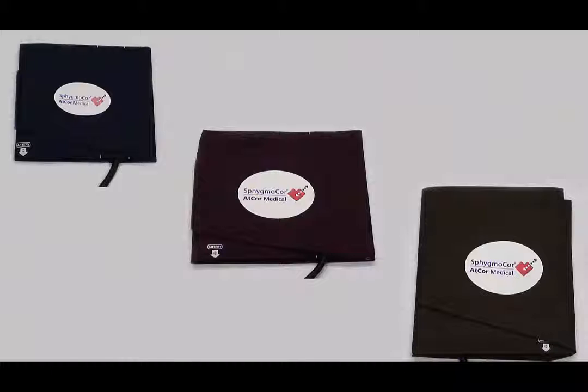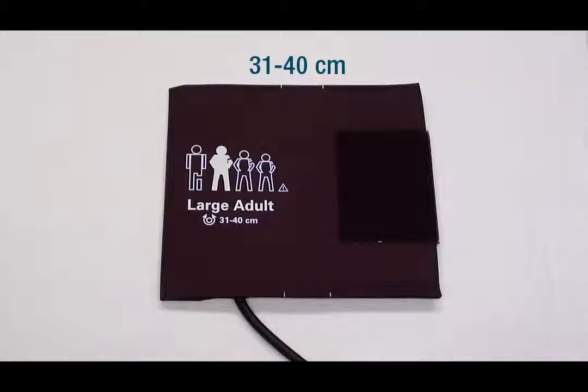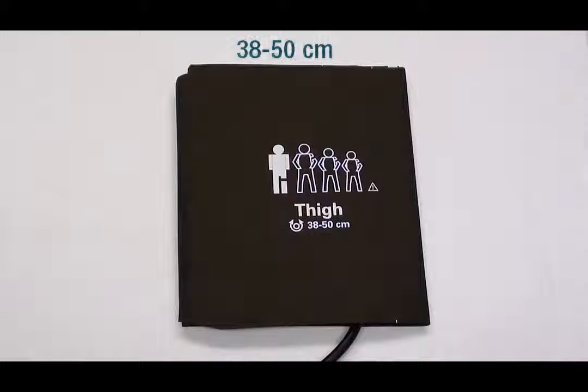The Sphygmocore Excel system comes with 3 different sized brachial blood pressure cuffs to be used when conducting a pulse wave analysis assessment. A dark blue cuff for patients with an arm circumference between 22 and 33 centimeters. A maroon cuff to be used on patients whose arm circumference is between 31 and 40 centimeters. And a brown cuff that fits arm circumferences of 38 to 50 centimeters. Note that the brown cuff has a thigh label. However, this cuff is only to be used on the upper arm for pulse wave analysis assessments.